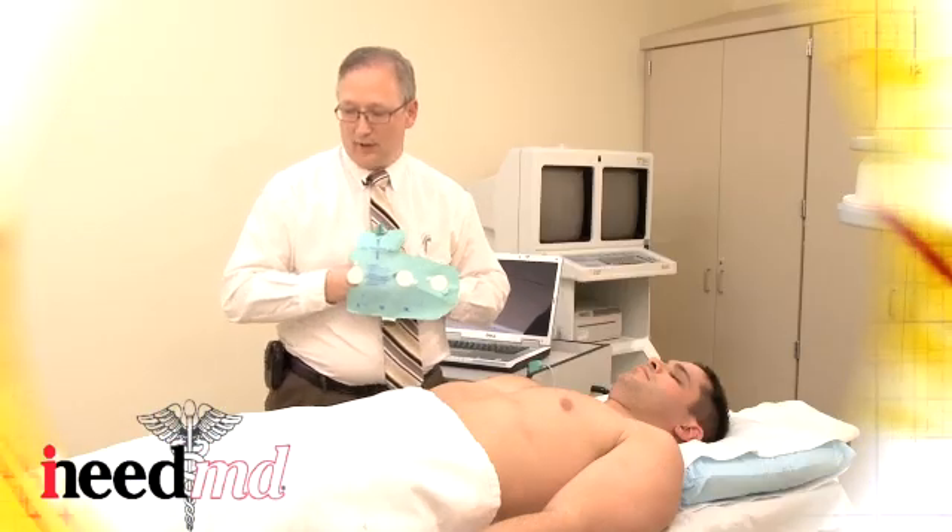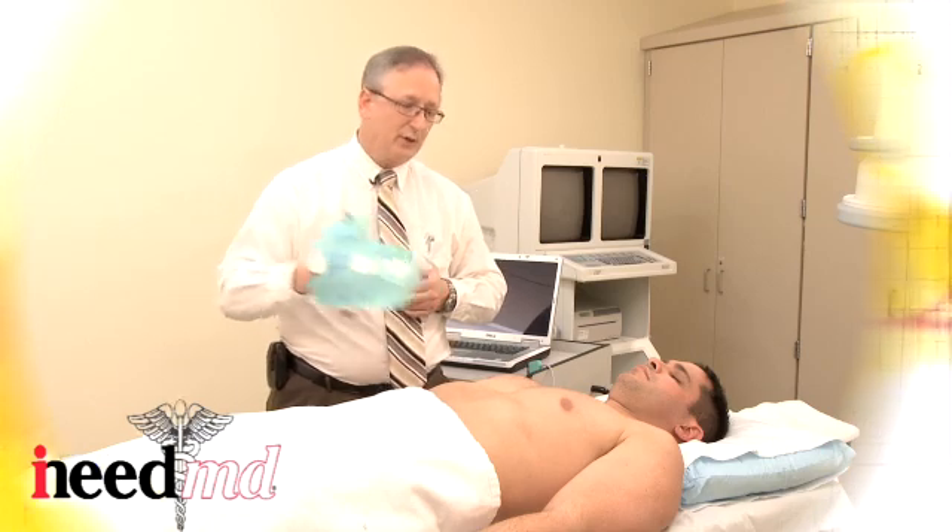The patient should be lying down with his legs straight and his arms to the side.